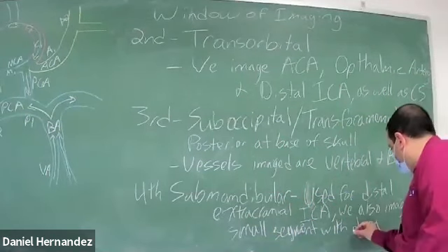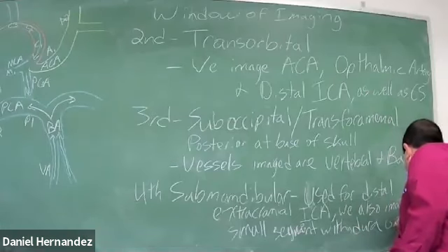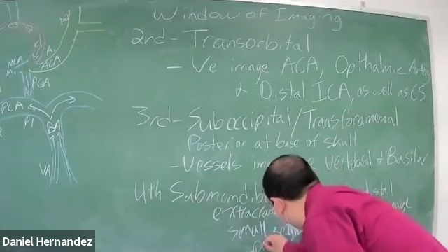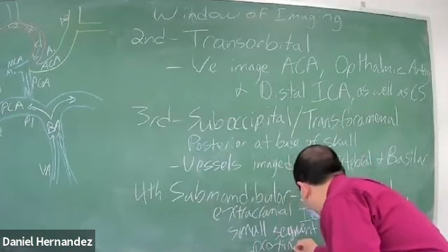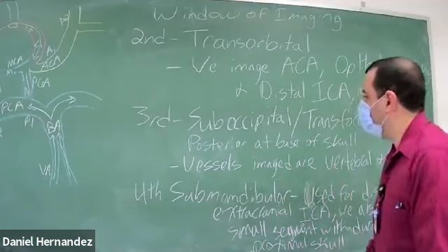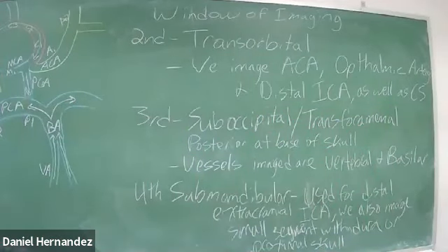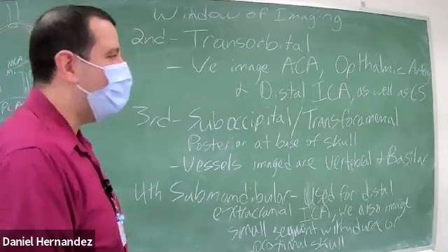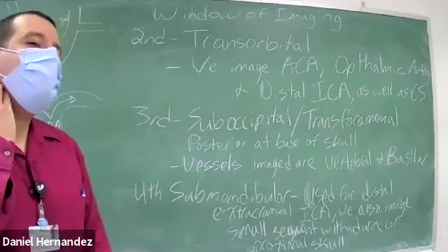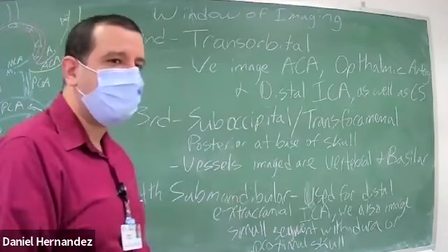A small segment within the dura, or proximal skull; you can say proximal skull. So here in the lab, I was having you go almost submandibular, trying to get as high as you can in that carotid artery.